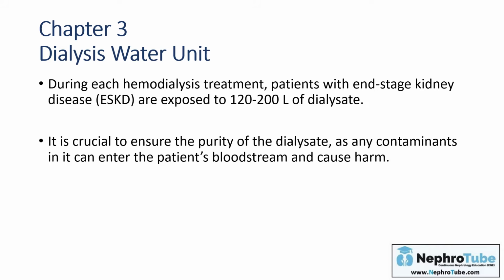As the patient is exposed to a large amount of water, it is important to be sure that this water is pure and the dialysate formed from this water is also pure. It must be free of any contaminants that can cause harm if they enter the patient's bloodstream.